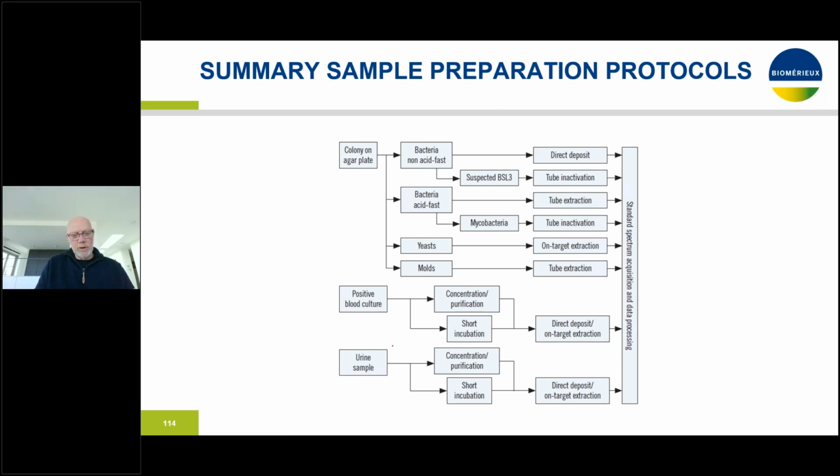And the same is true with urine samples. In case of urinary tract infections, the concentration of infectious organisms in the urine can be up to 10^5, 10^5.5, 10^6 colony forming units per ml. So there you can directly take some of the biomaterial, spin it, lyse it, do some preparations, and put the bacteria, without cultivation on a solid culture medium, onto the mass spec slide.